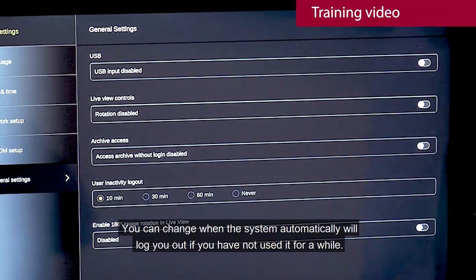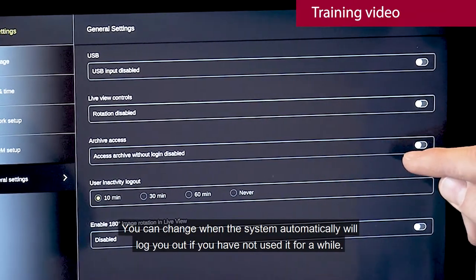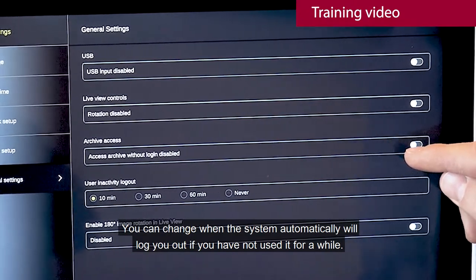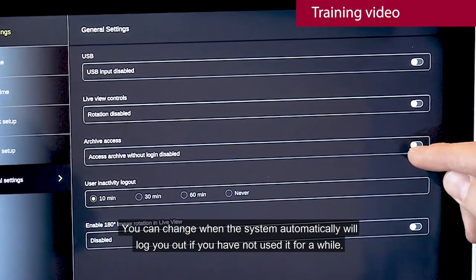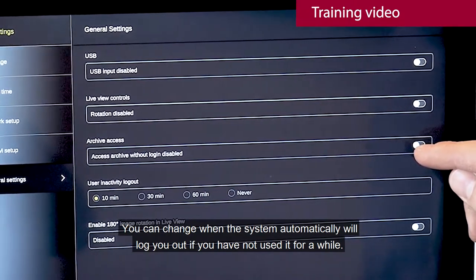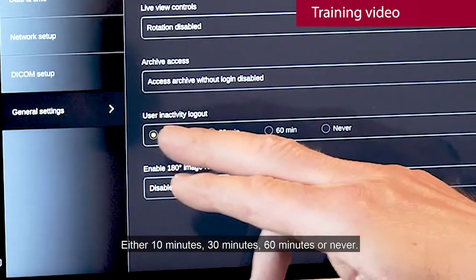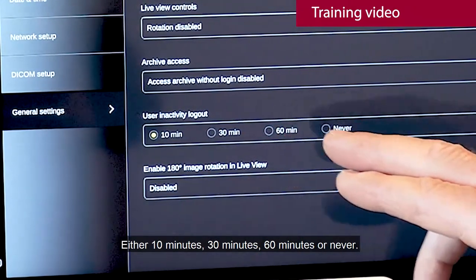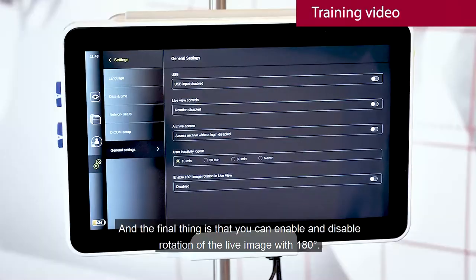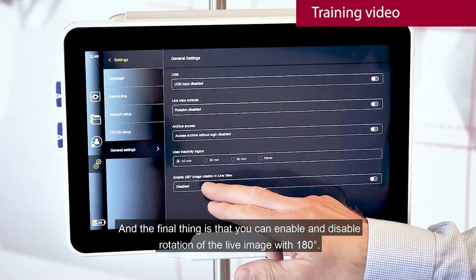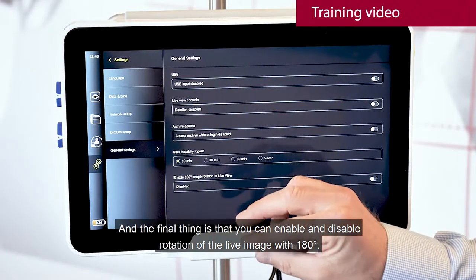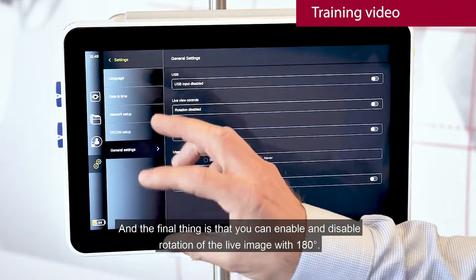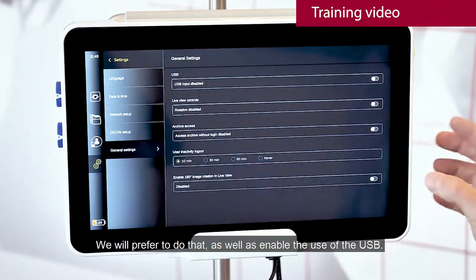You can change when the system automatically will log you out if you have not used it for a while: either 10 minutes, 30 minutes, 60 minutes, or never. And the final thing is that you can enable and disable the rotation of the live image with 180 degrees.